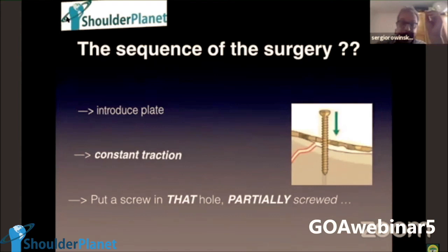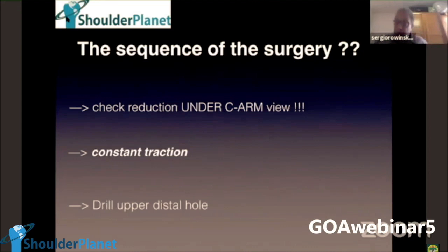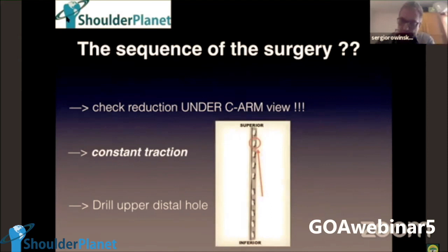And after that, I'm gonna check reduction under C-arm, always with traction in semi-flexion. There is someone doing this all of the time. Constant traction, this is a must. And then I'm gonna see the position to drill the upper hole under C-arm guidance, with traction all of the time. I use the distal hole from the upper part.